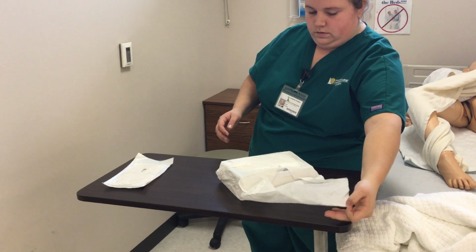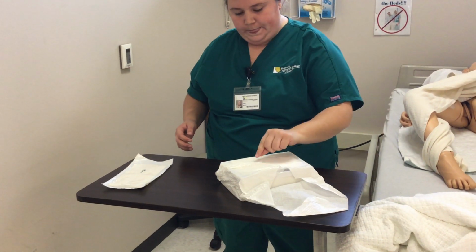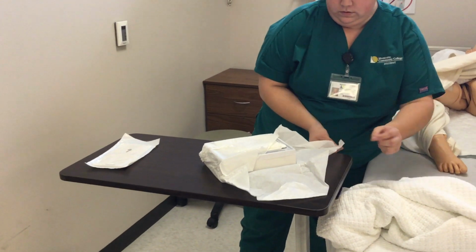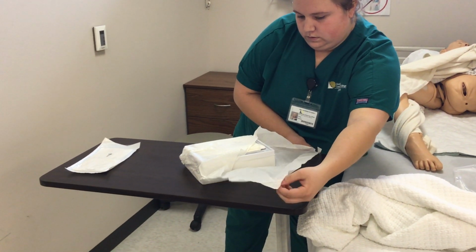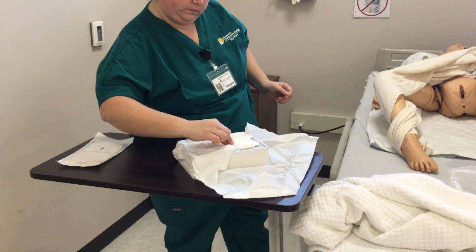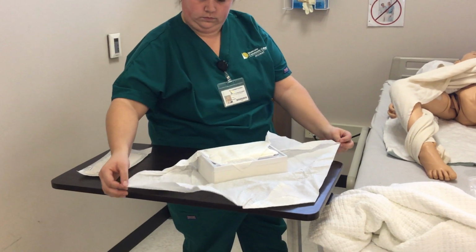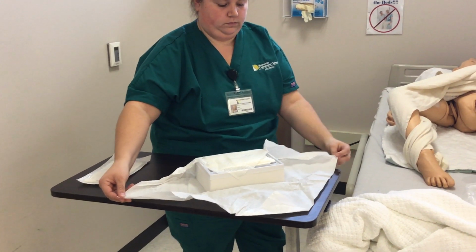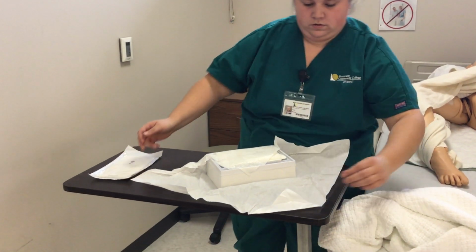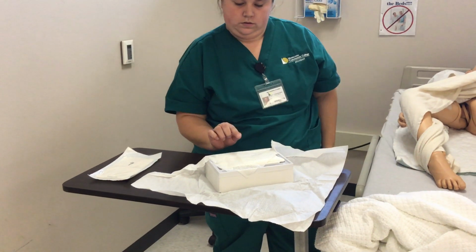So, once all that's said and done, we're going to get all our supplies ready, which I have in here. We're going to then get extra nursing personnel if necessary. And I'm going to explain the procedure to the patient. So we're going to give you a catheter because you have too much urine that's not coming out. So after that, I'm going to provide privacy. And then I'm going to perform hand hygiene and apply gloves.